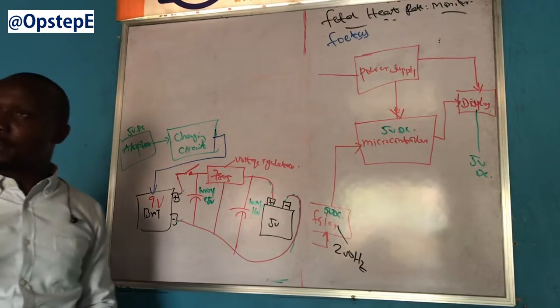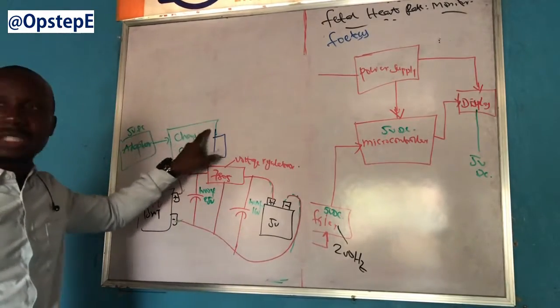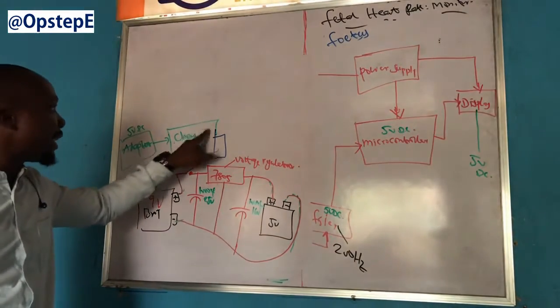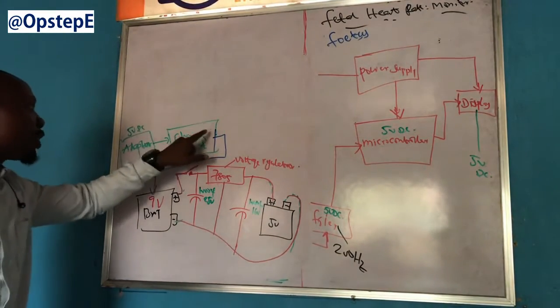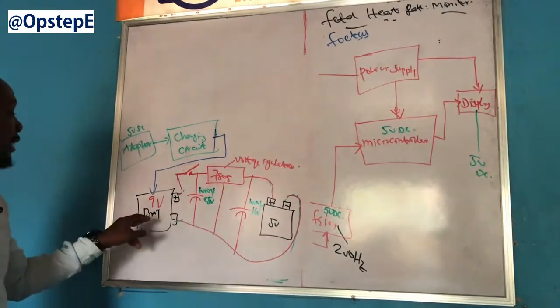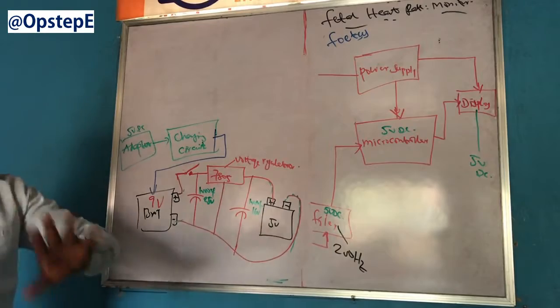I think it's 3.7, which is 7.4 volts. So at 8 volts from this charger, you have charged this battery. But since the charger itself is bringing out 5 volts, the adapter inside it is 5 volts, the battery is 7 point something volts. How then do you expect the 5 volts to charge the 7 point something volts? Do you understand that? Unless this battery has been externally charged before, that is when the charger can then be helping it to top it up.